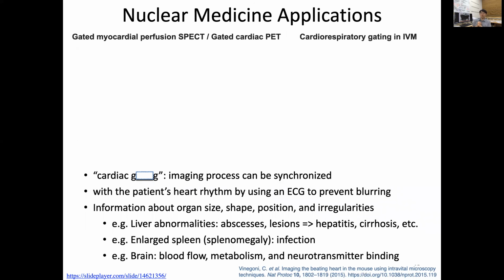So now I want to change a little bit to this imaging in a practical aspect. For applications, we want to measure heart dysfunction, especially if there's a myocardial infarction. I want to find out if there's any lesion, which is an under-perfused area of the heart. The problem is that our heart beats all the time, and imaging this beating heart is very challenging. So we need to devise smart ways of handling the heart beating.